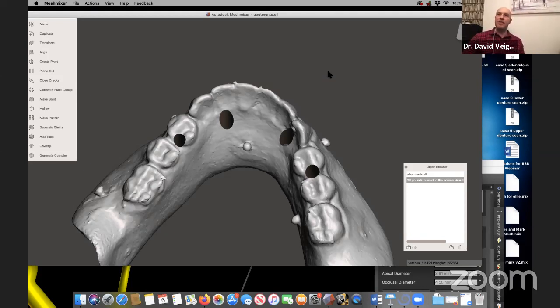And the purpose of this is, with the modifications I want to make in this next restoration, this next temporary, that isn't quite there yet. I want this next temporary to be 99% there. So I give this 3D printed trial version to the patient, and I then take my next set of photos, and I look at those photos, and we look at them together, and we say, okay, maybe we need to shave this, maybe we need to shave that, maybe we need more length. Whatever we do, we need to do to it.